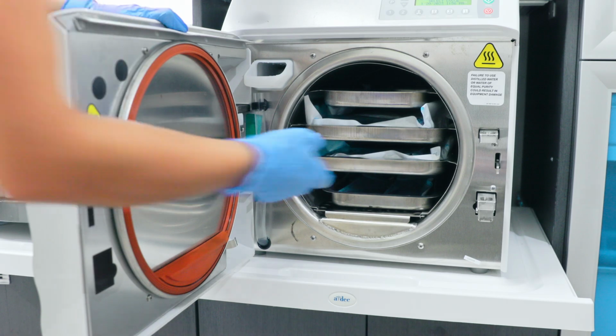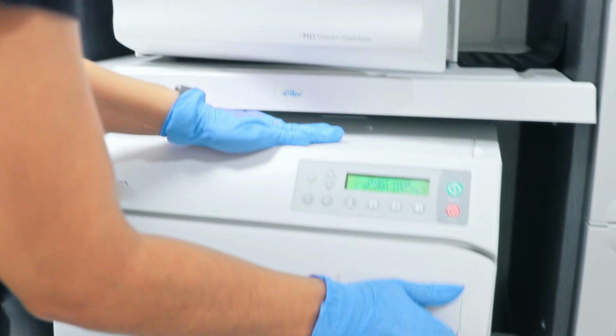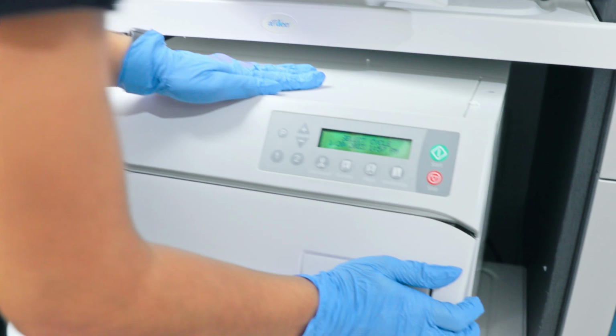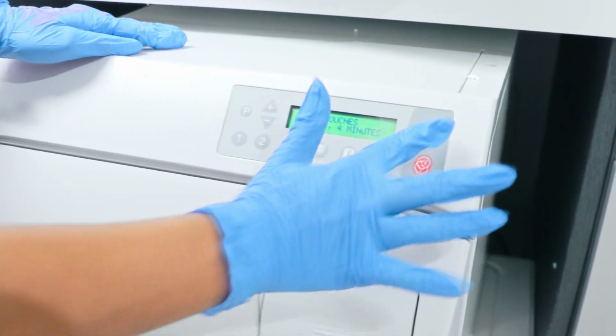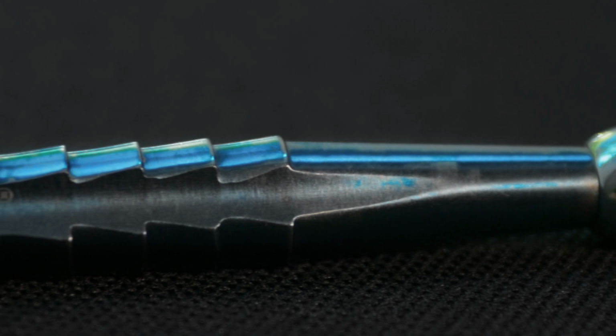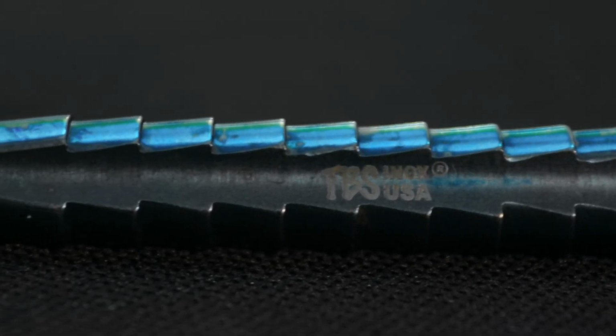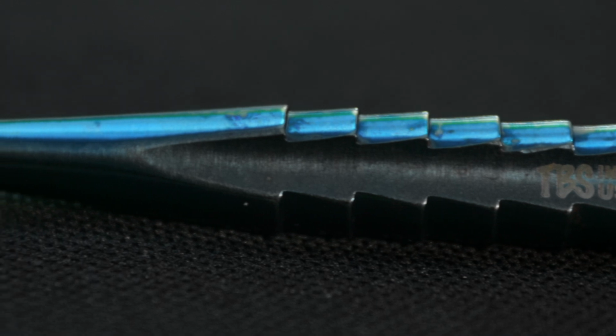Never exceed temperatures of 350 degrees Fahrenheit or 177 degrees Celsius, as this will harm the hardness of the steel. Only use fully demineralized or distilled water in the autoclave or sterilizer. The use of tap water will result in deposits and corrosion on the instruments and the sterilizer.